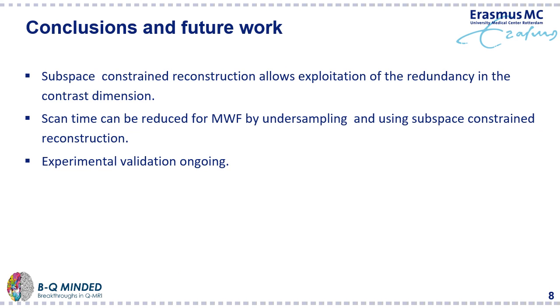Therefore, we conclude that subspace constrained reconstruction can be used to exploit the redundancy in the contrast dimension without explicitly using a model. Scan time can be reduced by undersampling and using subspace constrained reconstruction. Further validation using a prospectively undersampled scan is ongoing.